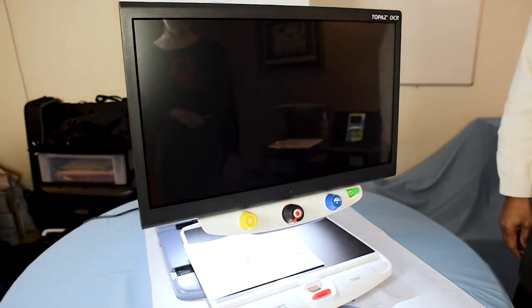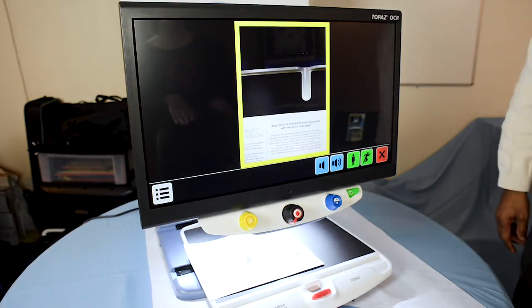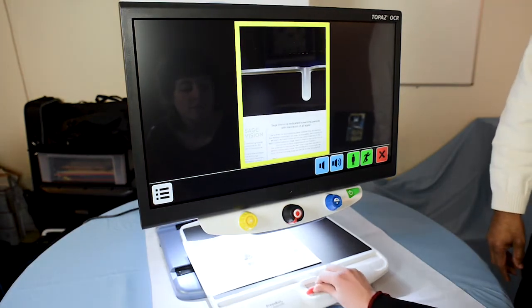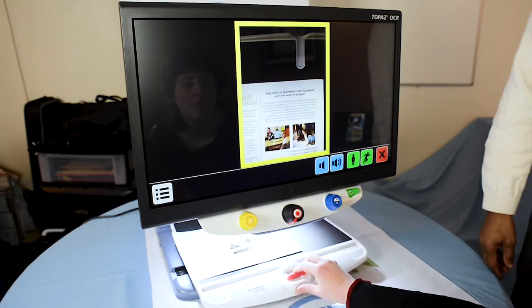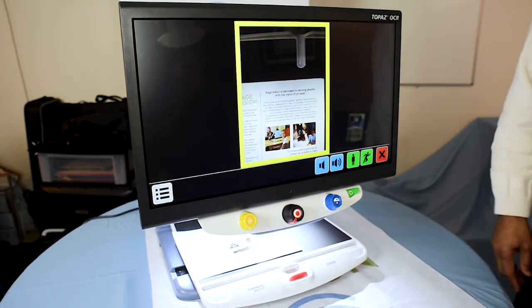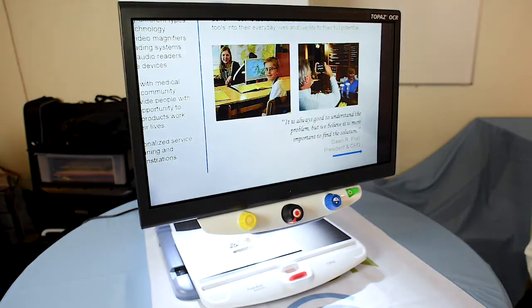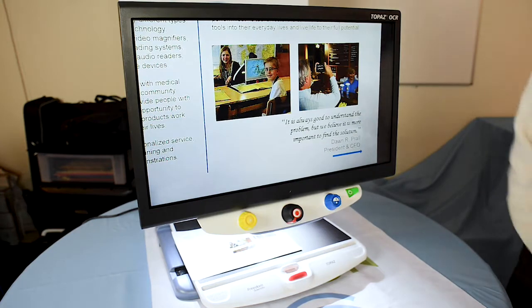Position the text inside the window and tap the screen. It prompts you to position the text you're trying to read within the yellow box. Once you have that positioned, you simply tap the yellow box and it will scan a picture of the document you're trying to read.